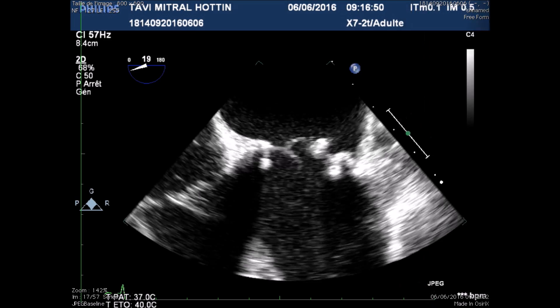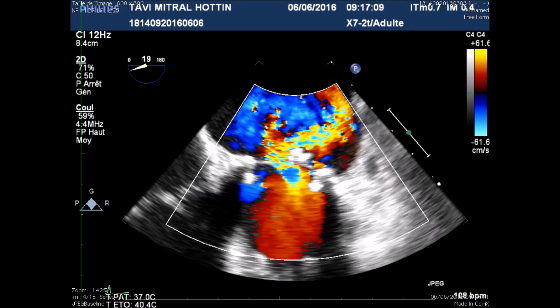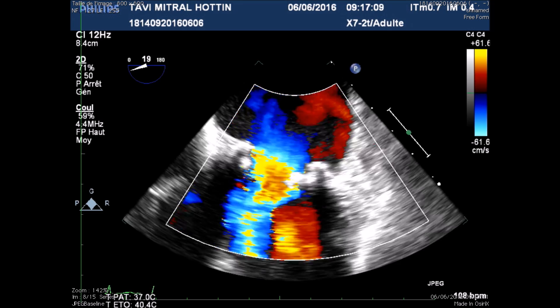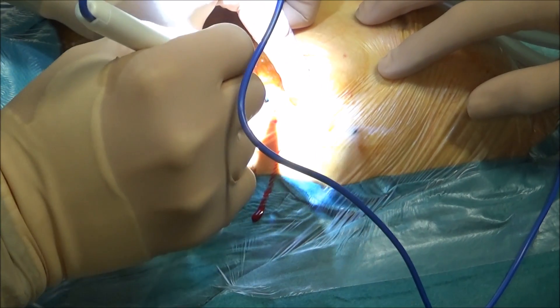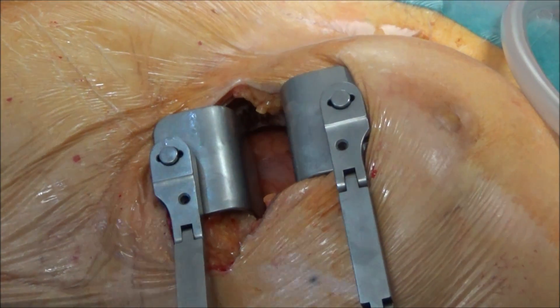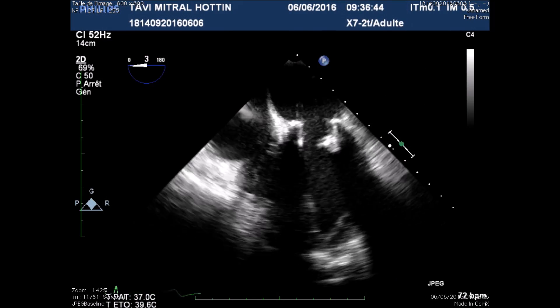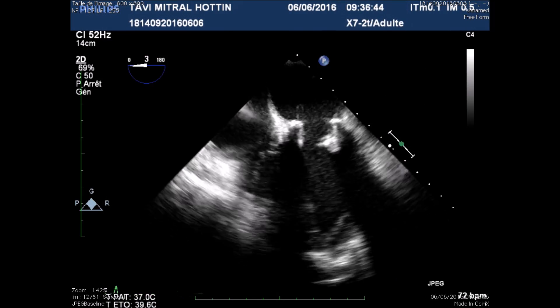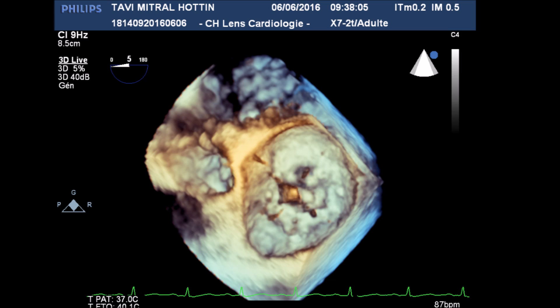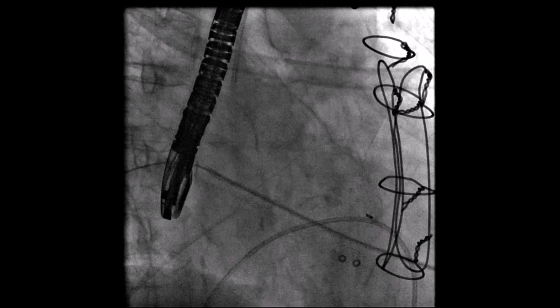The initial TEE at the beginning of the procedure showed the ruptured cusp with severe mitral insufficiency. The surgical apical approach was done as usual at the level of the fourth intercostal space. The standard J-shaped wire was placed through the valve and confirmed with three-dimensional TEE.